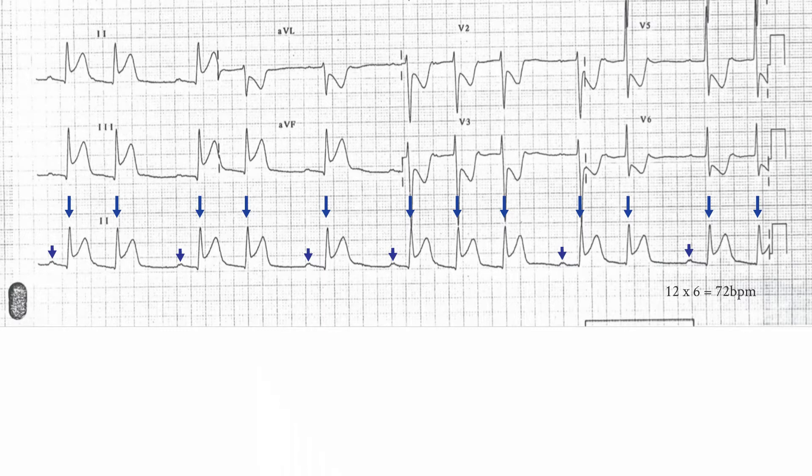There are also complexes that don't have an obvious P-wave preceding them. These are identical in morphology to the sinus beats and are therefore supraventricular beats and probably supraventricular ectopics. The rhythm is therefore probably sinus rhythm with supraventricular ectopics.